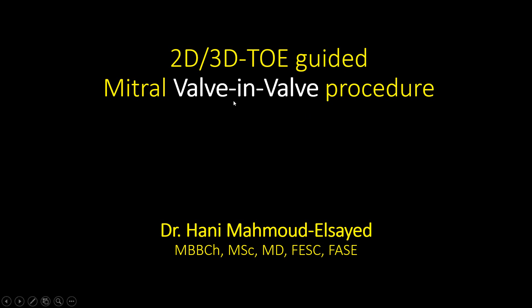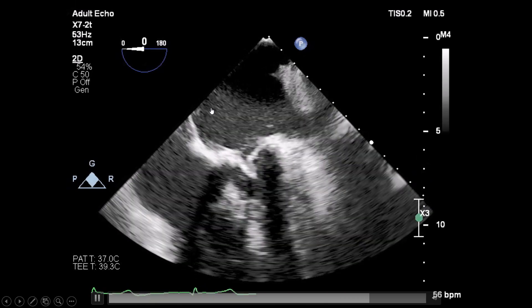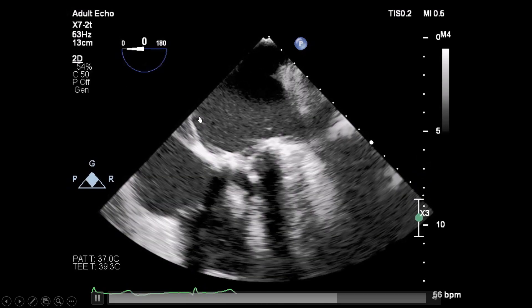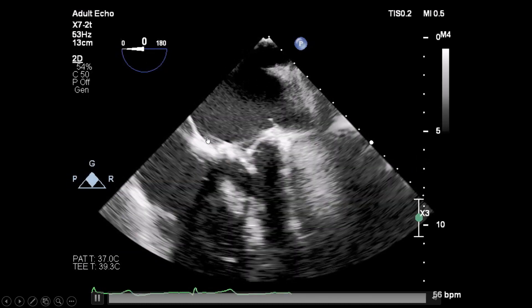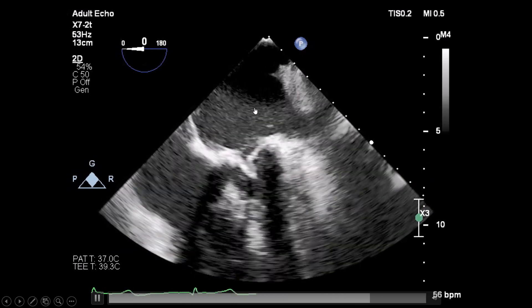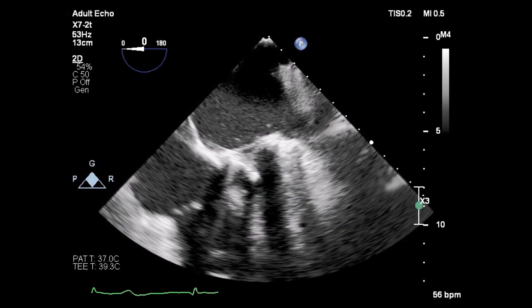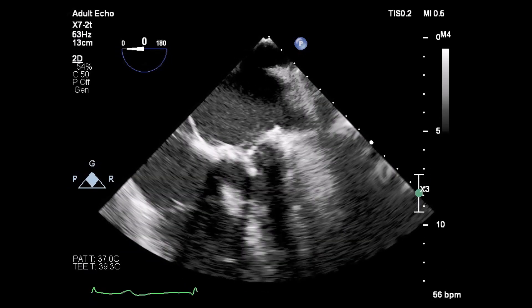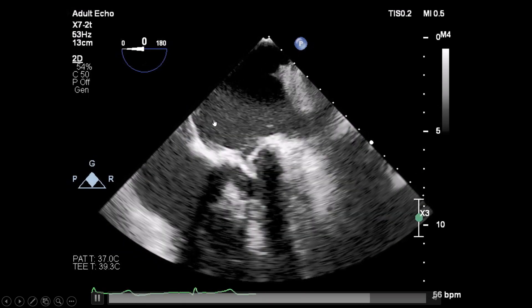This is a case of 2D/3D TEE-guided mitral valve-in-valve procedure. This patient had a mitral valve bioprosthesis a long time ago and presented with a degenerated, severely stenotic as well as regurgitant mitral bioprosthesis. Because of high surgical risk, the decision was to go for a percutaneous mitral valve-in-valve procedure using an Edwards SAPIEN valve to be implanted within the mitral bioprosthesis.